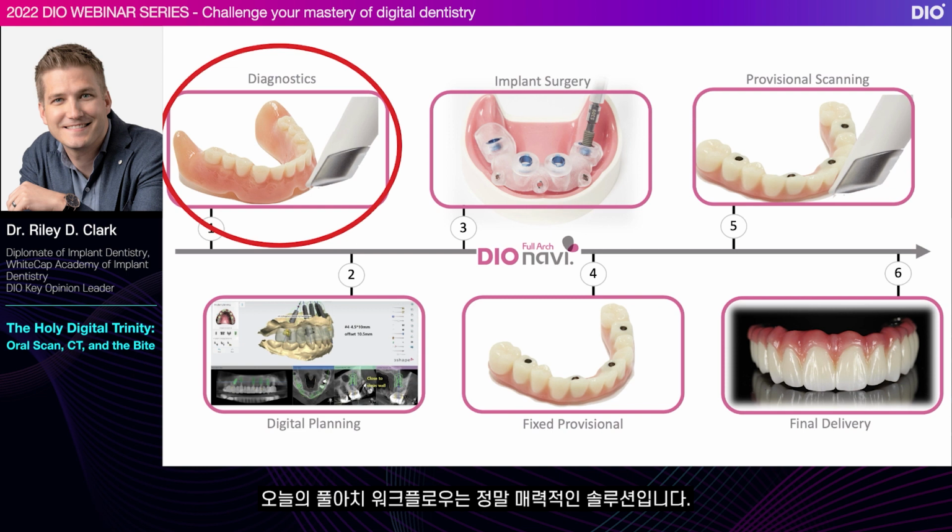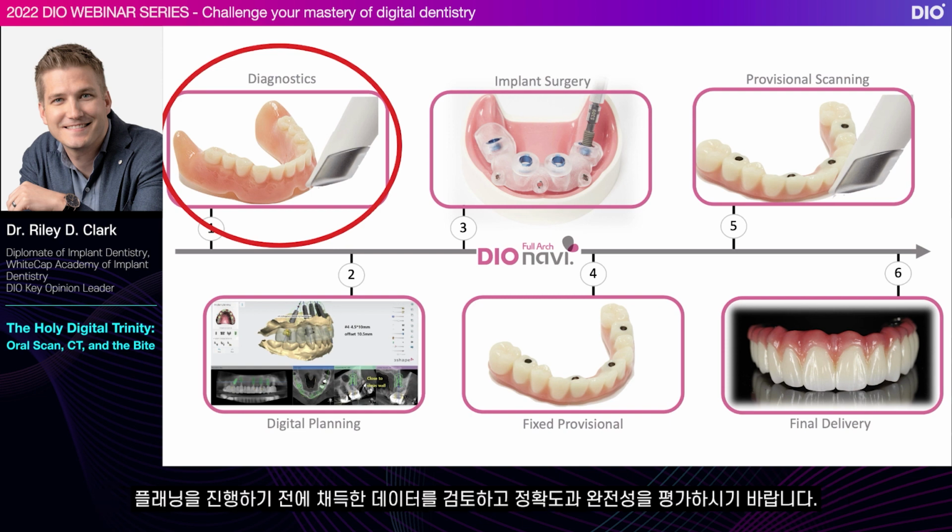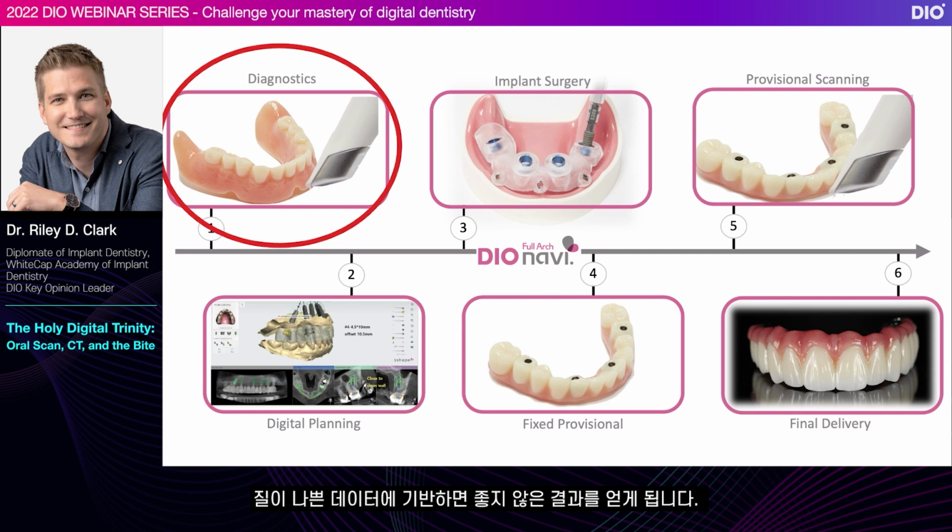Our workflow today for full arch is really, really compelling. It is efficient, it is powerful, but it has to start with proper diagnostic data. So as you tackle your next cases, I invite you to be extra thoughtful with the intraoral scan you obtain, the CT you obtain, and the bite you obtain. I want you to look at it and evaluate it for accuracy and completeness before you move on with your digital planning, because if you're planning off of poor data, you will have poor outcomes.